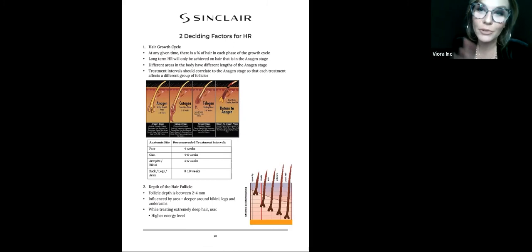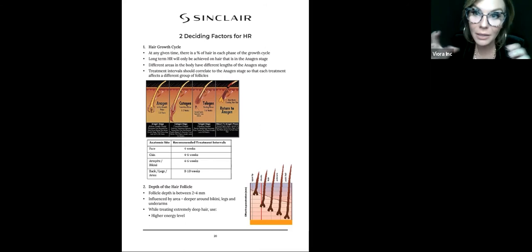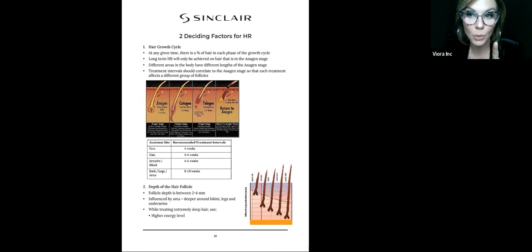What's important is after you've done the first treatment, how you space it out from there, to where we're giving enough time to get the most that we can of those hairs back to the anagen phase to then do another treatment. So face is every 4 weeks, and then hormonal areas, chin, underarms, bikini is every 4 to 6 weeks. It's actually best to wait 6 weeks. There are more hairs in the anagen growth phase at 6 weeks for those areas.